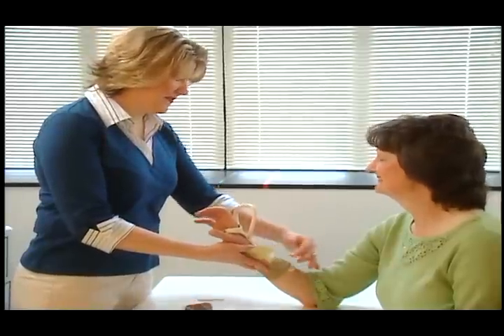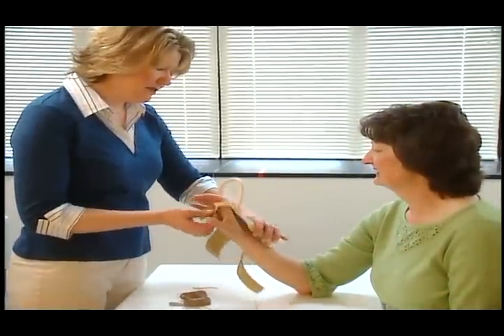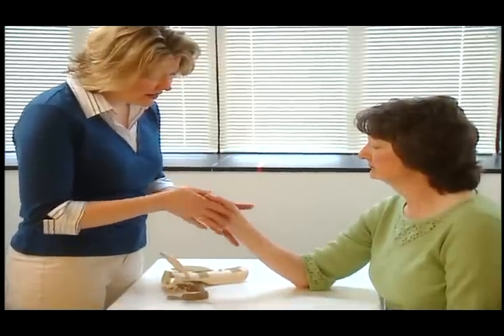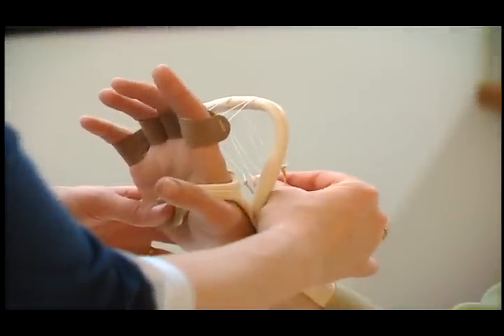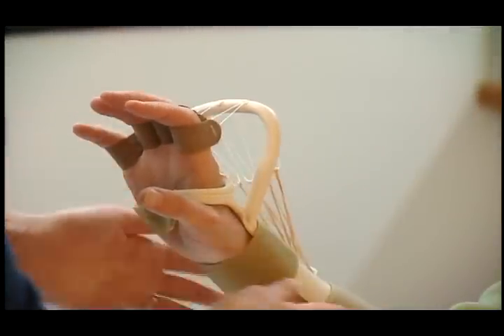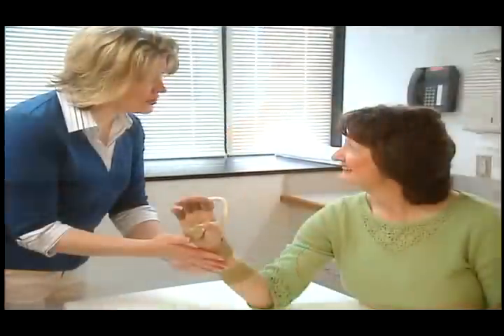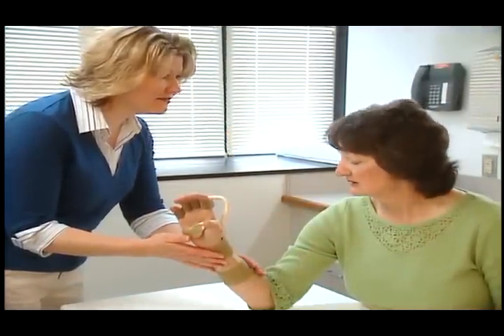Have the patient wear the splint for 20 minutes, then remove the splint and check for any areas of redness or blanching on the skin. This may indicate that there is too much pressure on the area. If the splint has a dynamic component, check to be sure that the angle of pull is correct and the splint base is not being pulled distally by the traction force. Make any changes necessary to ensure the splint is fitting properly. It is also important to educate the patient on proper application and care of the splint to ensure compliance.